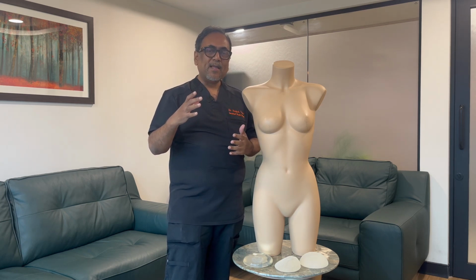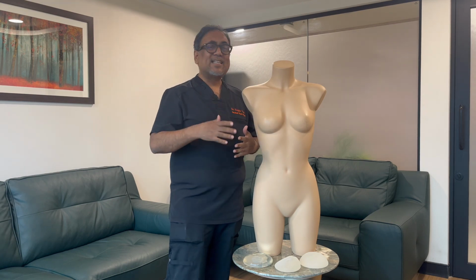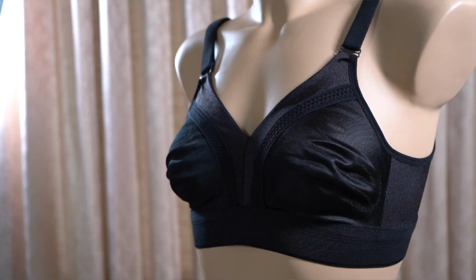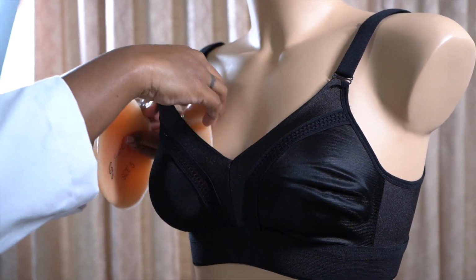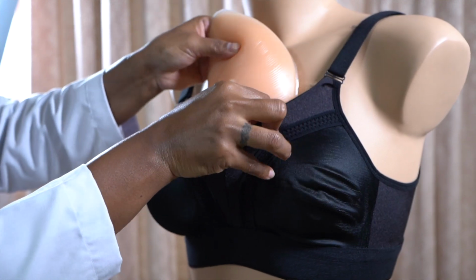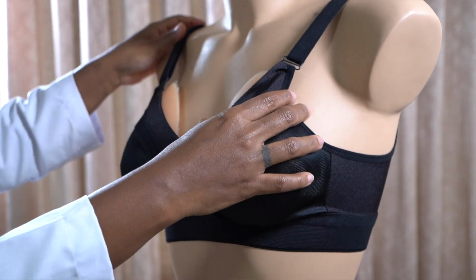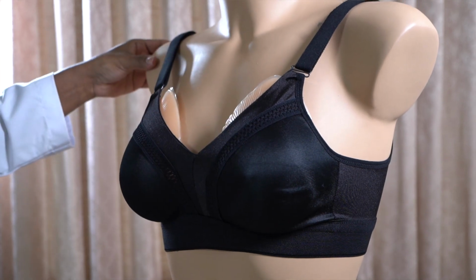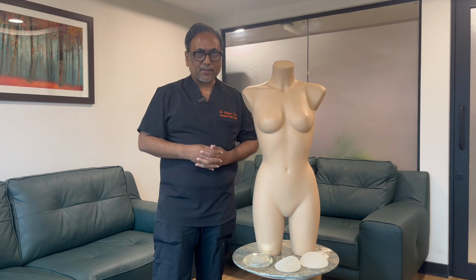So we get an idea, and we also have what is called an external sizing system, where the patient is made to wear an implant in the bra. Based on the dimension of the implant which we get by measuring the base diameter, that particular implant is put in the bra, and the patient stands in front of the mirror and sees for herself whether that is suitable or not.